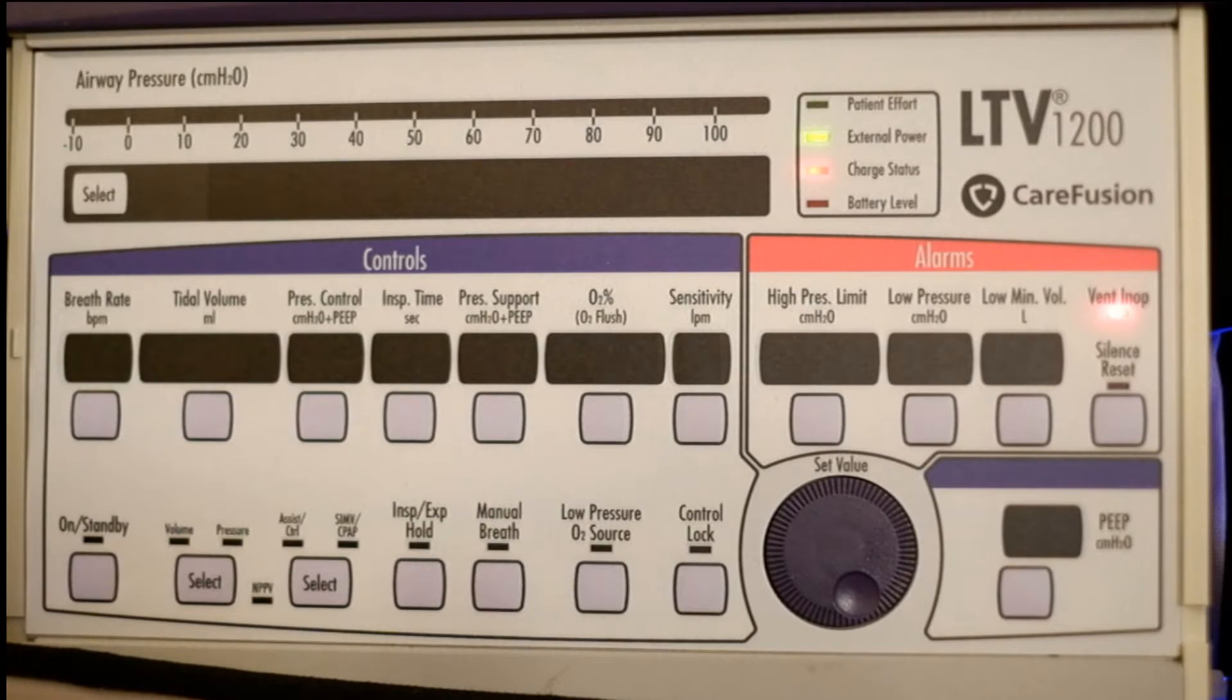The first thing we have to understand with the LTV-1200 regarding BiPAP is that it's an additive. With BiPAP, there's additive and absolute. An absolute BiPAP is usually what you'll find in the hospital, a standalone BiPAP machine. What that means is if you set it at 15 for pressure support and PEEP of 5, they're going to receive 15 over 5, exactly what it says. It's absolute.